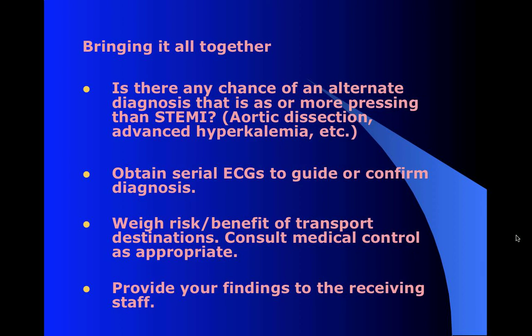If there's something else you think, is it equally or more dangerous to the STEMI? Maybe the hyperK or the dissection, you don't want to miss those. So get your serial 12 leads, consider the possibilities, and that depends on your local situation, where you're transporting to. Maybe you have to decide between a trauma center or a STEMI center, or your STEMI center is maybe an hour away, so you got to consider the risks and benefits.